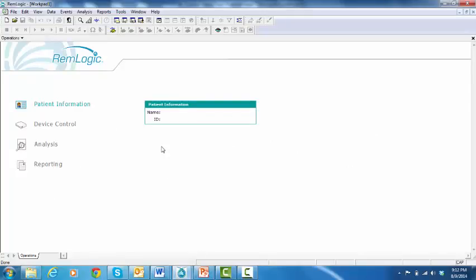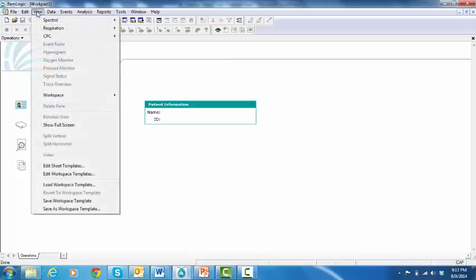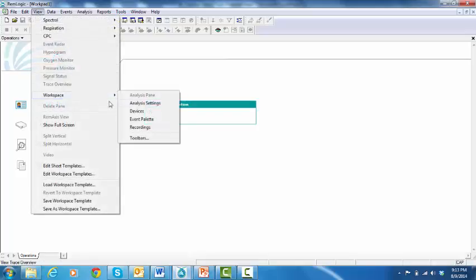In this video, I'm going to demonstrate how to create an analysis profile. Go to View, Workspace, and select Analysis Settings.